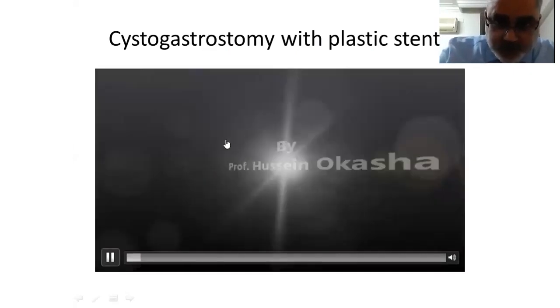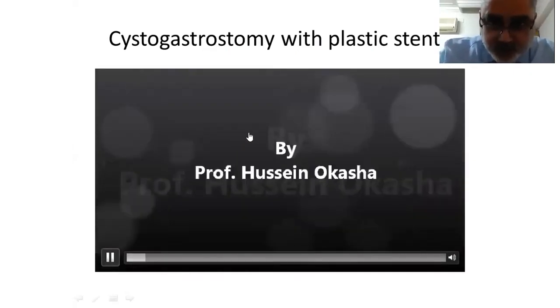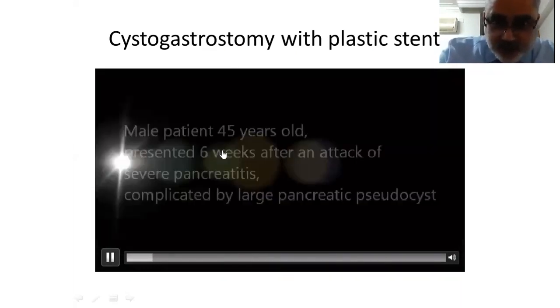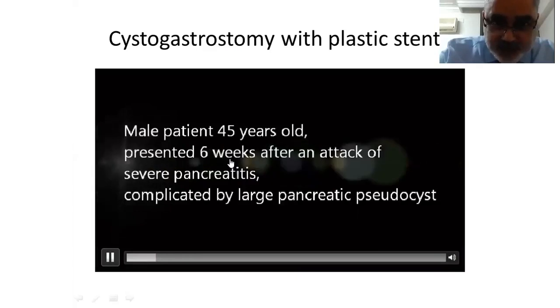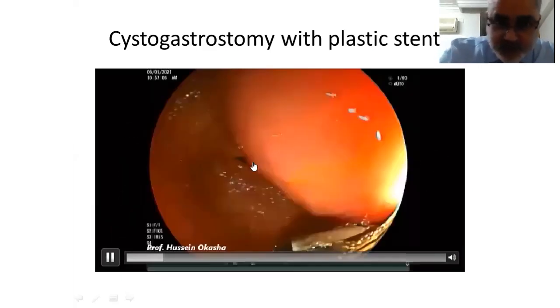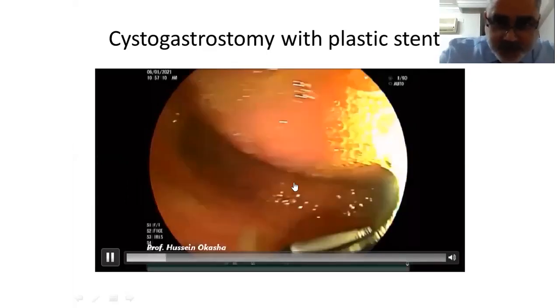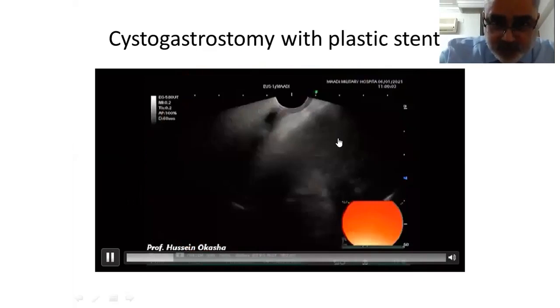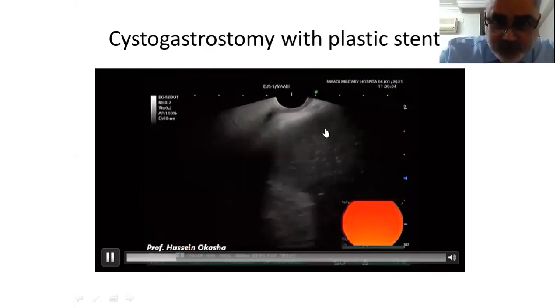Our patient is a 45 years old male with acute pancreatitis and a cyst present for 6 weeks. So there will be a well-formed wall. This will minimize leakage as much as we can. This is the bulge seen by the endoscopic view of the echo endoscope. And then this is the cyst.